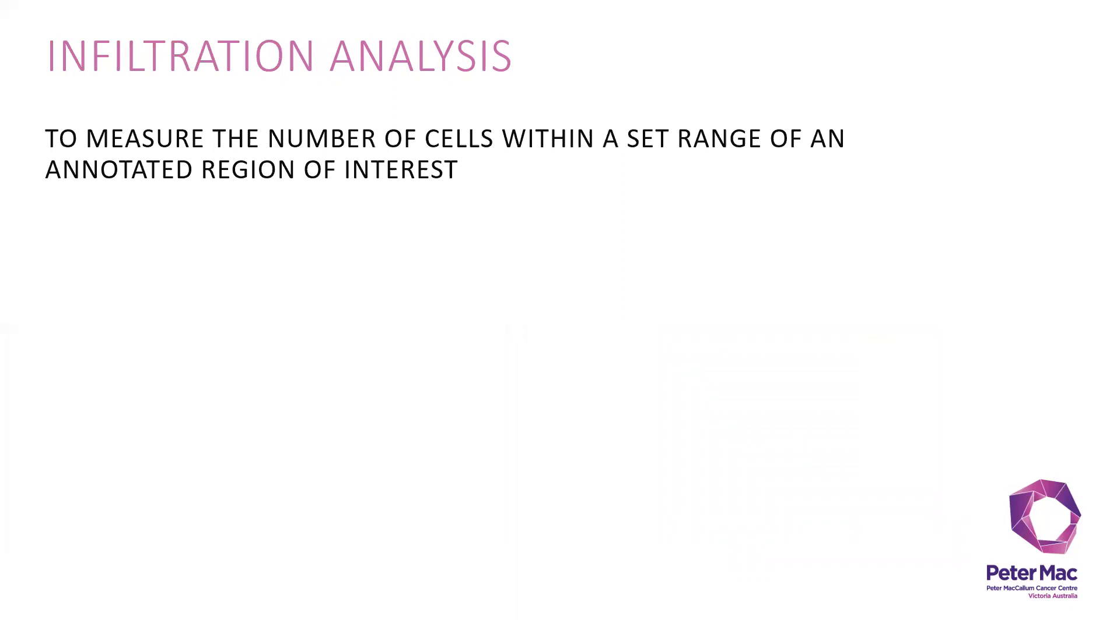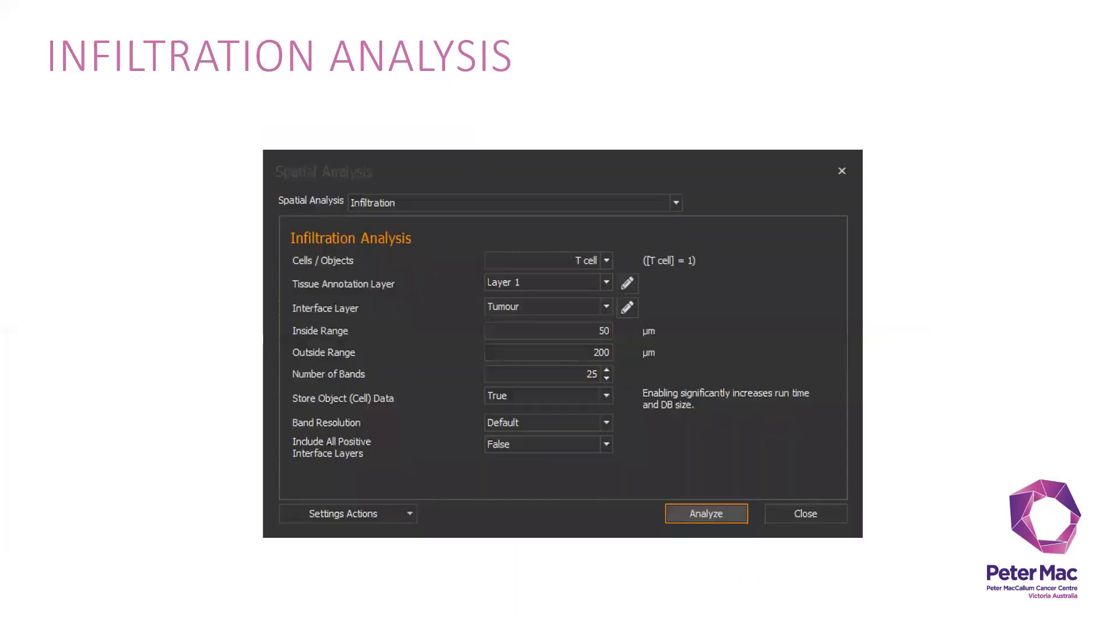For infiltration analysis, it's used to measure the number of cells within a set range of a region of interest. This is where the automated annotation using classifier comes in handy. I would like to measure the T cells within the tissue layer corresponding to tumor inside the tumor, 50 microns, and then outside of tumor, 200 microns, with 25 bands, giving me a 10 micron range.